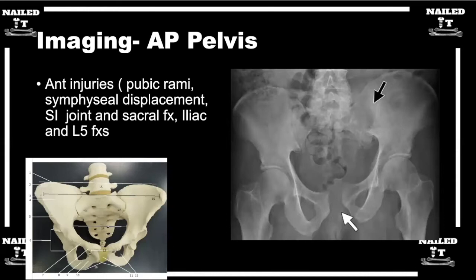What do you look for on an AP pelvis in patients you're concerned may have a pelvic ring injury? The natural thing that all of our eyes go to is looking at asymmetry. If you look at the image on the right side, you can see that the left hemipelvis of this patient is dramatically different than the right side. Your eyes are always drawn to the most obviously different thing, whether that be fracture or ligamentous disruption, as is in this case.